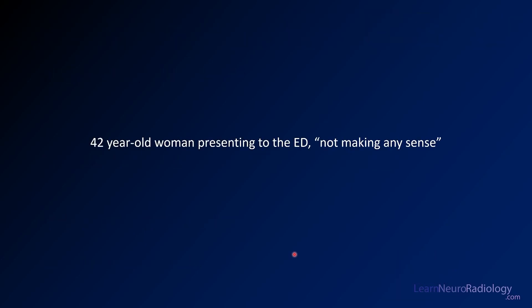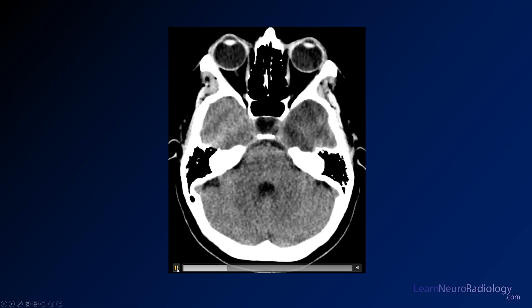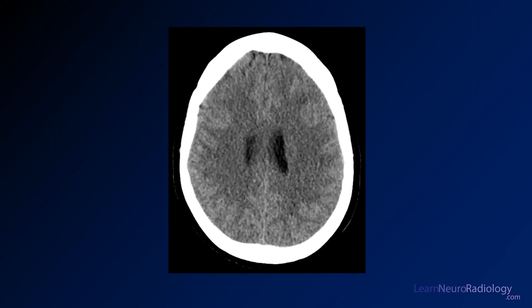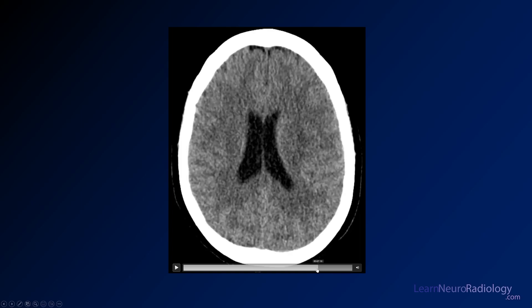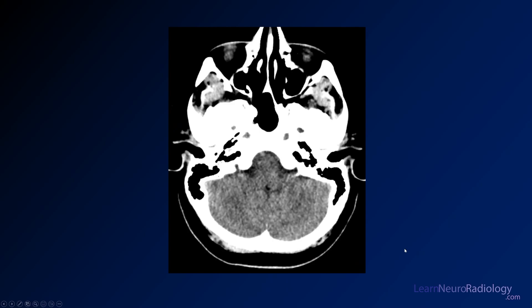Now we're going to take a look at a case — a CT from a 42-year-old woman coming to the emergency department, not making any sense. Here we have some images from a CT. This is a scrollable movie; I'll play through this so you can take a look. What you can see is there's a lot of edema in the left cerebral hemisphere, some of the basal ganglia, insula and sub-insula regions, going down the temporal stem into the temporal lobe. It definitely looks swollen and expanded — we have to think about the possibility of tumor.